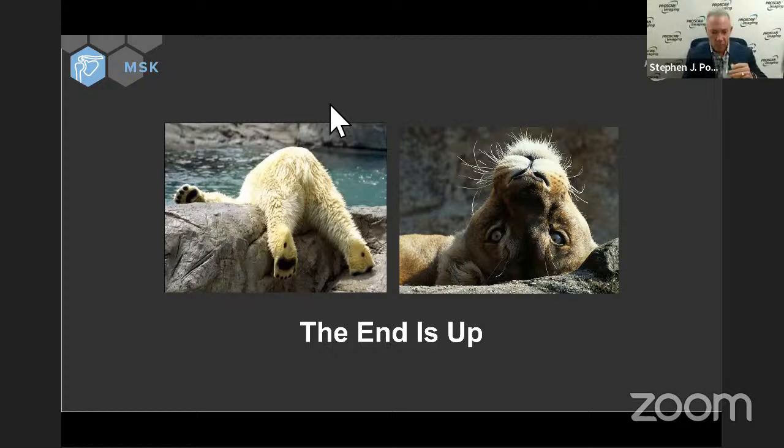Well, for the ulnar nerve, you've got to have one critical sequence, and that is high quality axial imaging. And I like to have a T1 and a T2 spin echo. I find the proton density axial spur less valuable because the nerve's always going to be bright. You're looking for the caliber of the nerve, its consistency, its position in the groove. I don't want to see the nerve go light to dark to light. I like to see it have a homogeneous gray signal intensity.